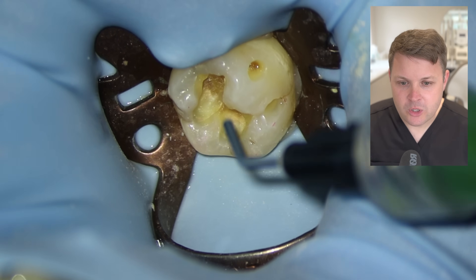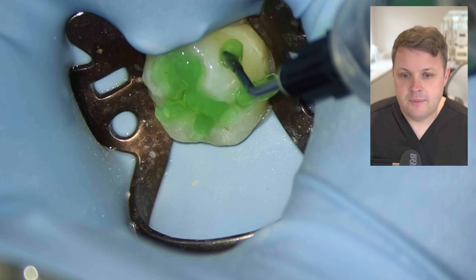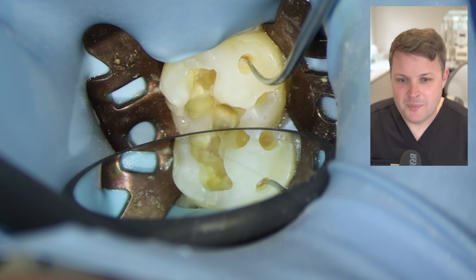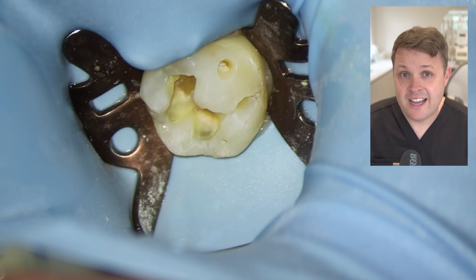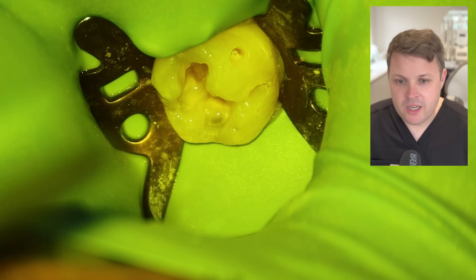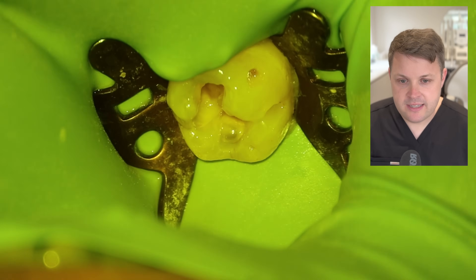There's a tiny bit of decay remaining in this tooth, so I'm taking my time. When we look at the tooth now, it's nice and clean. I'm going to do some selective etching — I'm not going to use Scotch Bond self-etching bond; I'm going to use iBond. I'll etch the enamel and place just a tiny bit of etch on the dentin. Then I'll click the microscope over to the blue filter and very gently and thoroughly place the bond into the tooth tissue, massaging it in to get that glassy appearance.